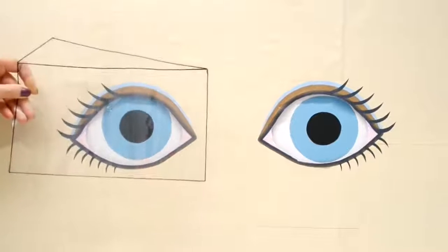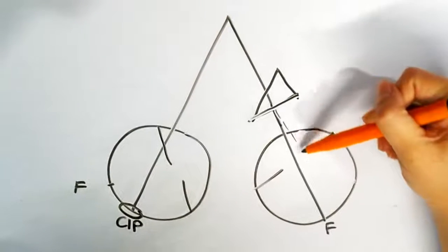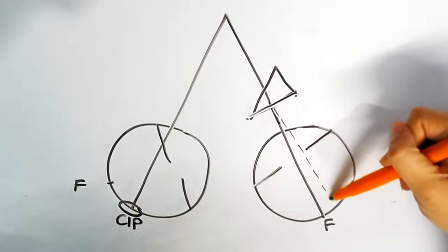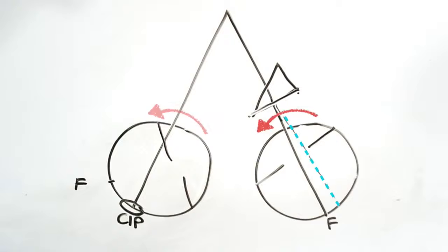When we put the prism on the non-deviating eye, you should see the eye under the prism move in and the conjugate movement of the other eye moving out. You won't see the conjugate eye moving back in to retake fixation as the image has now fallen on extensions of Panum's fusional area.